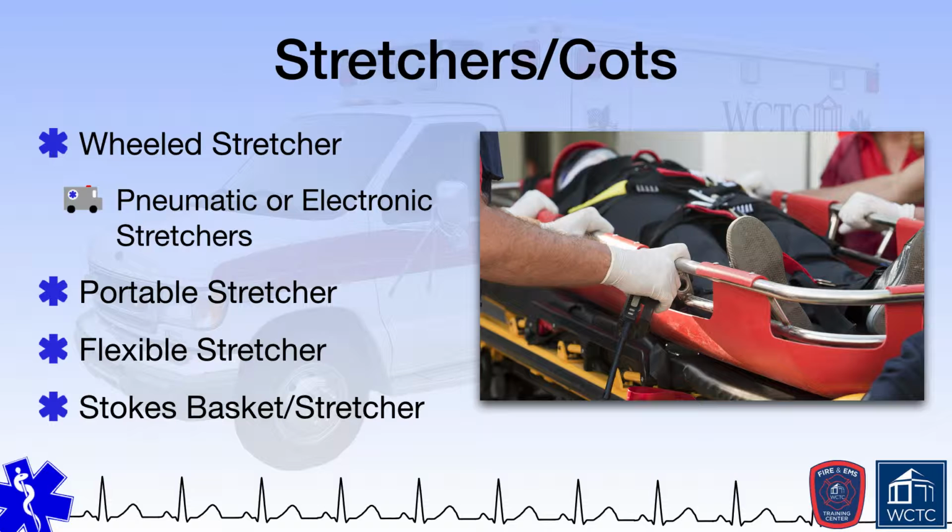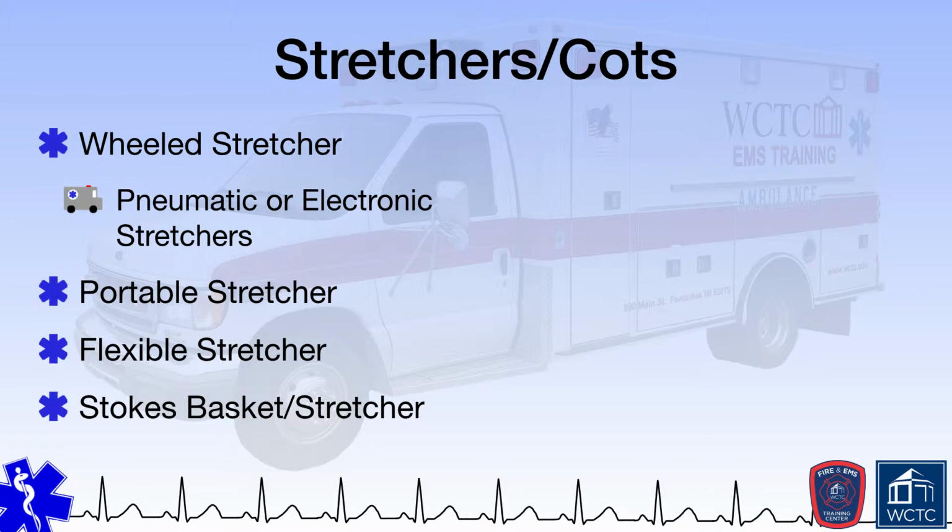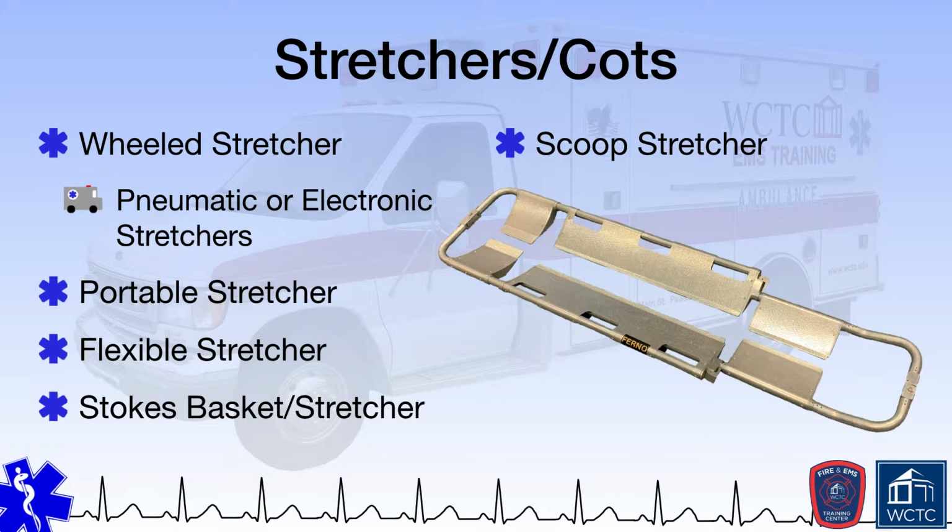This particular stretcher is made of rigid plastic, composite, or metal with an extended lip that comes up around the entire device. Handles are built directly into this lip, which allows for easy carrying by EMS providers. These basket stretchers are large enough to accommodate the length of a rigid longboard and, if rated for the particular use, may be used along with rope systems to extricate patients from limited access and remote areas while also providing for spinal immobilization.